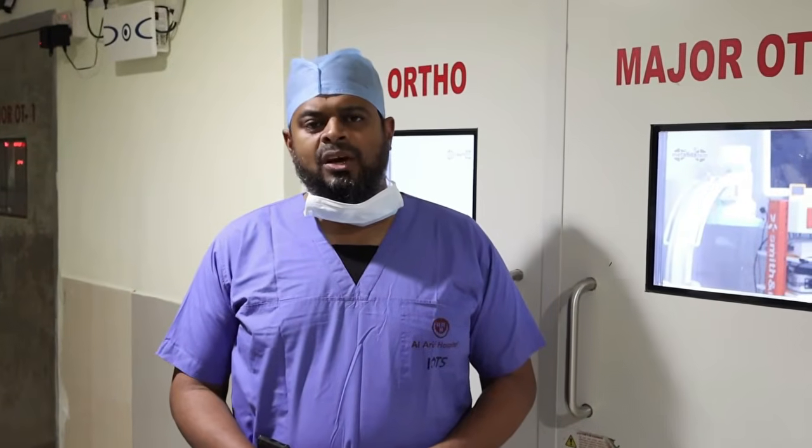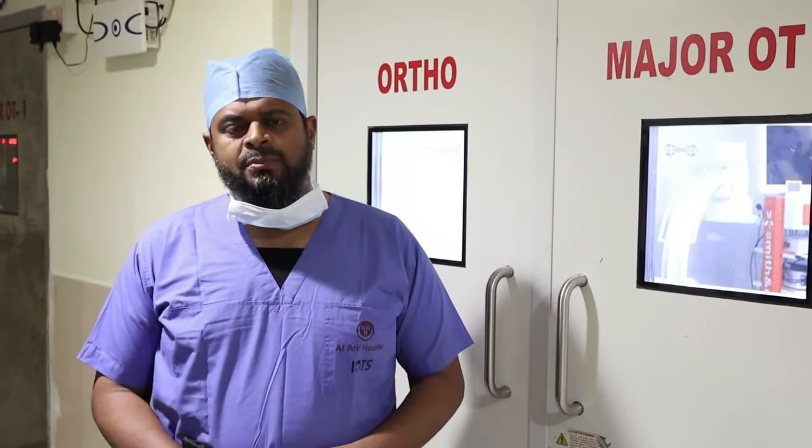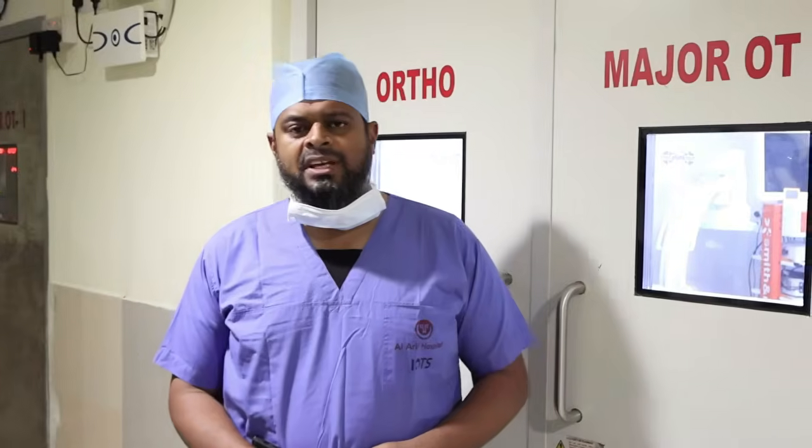Hello all, today we will discuss two cases of RAMP lesion, how we can identify a RAMP lesion arthroscopically and how we can proceed with a repair of a RAMP lesion. A RAMP lesion occurs in the medial meniscus, in the posterior horn, in the background of an ACL tear. With no further ado, we can go into the details of the surgery.